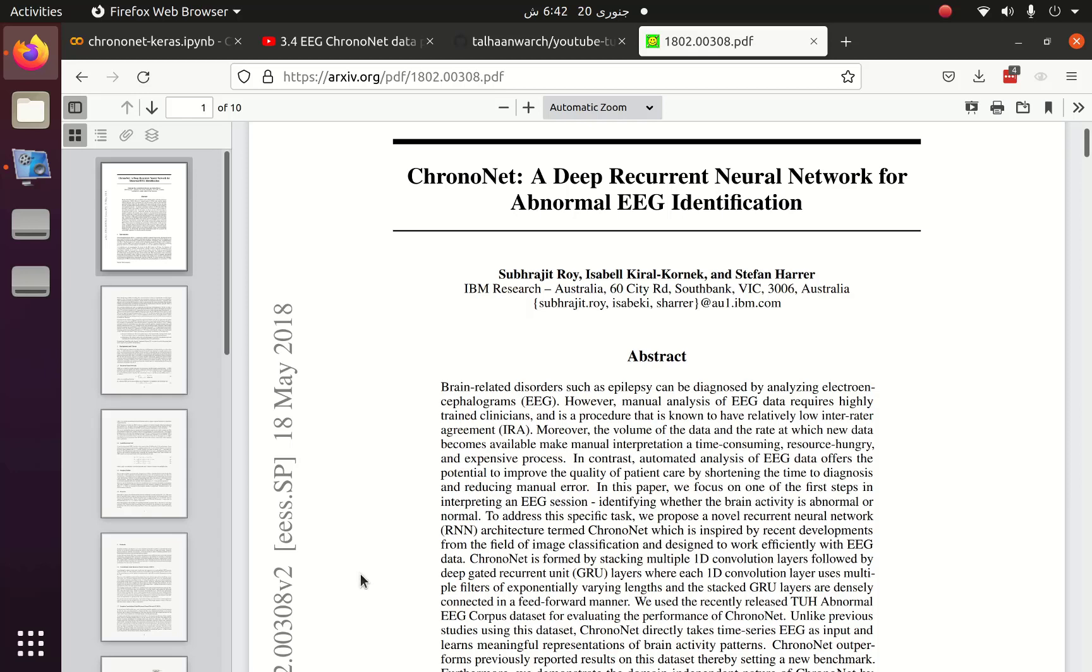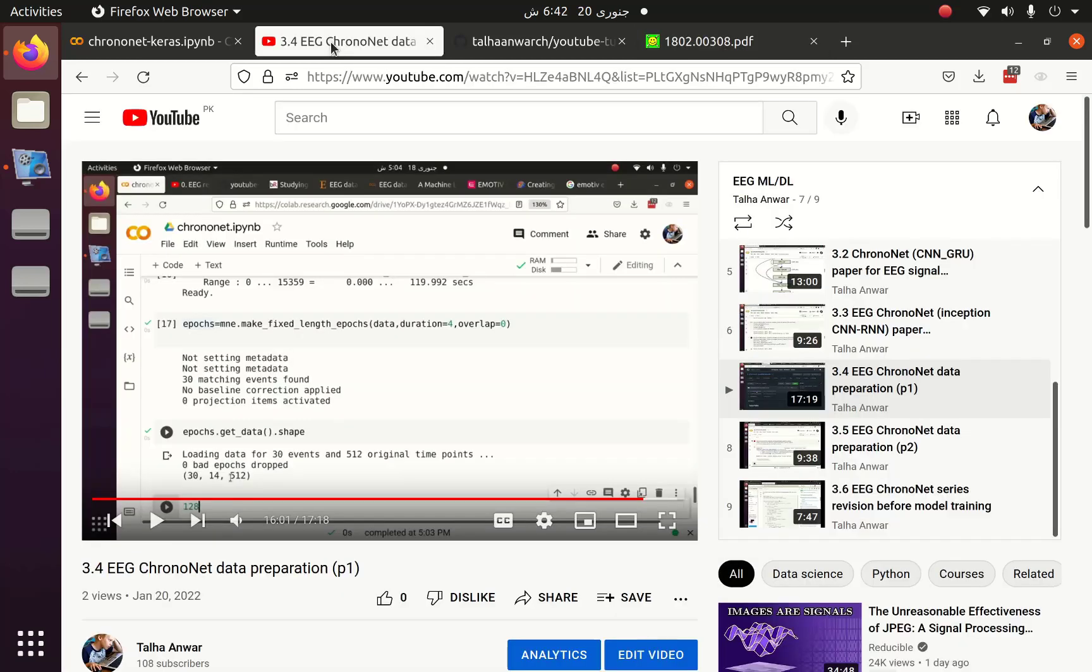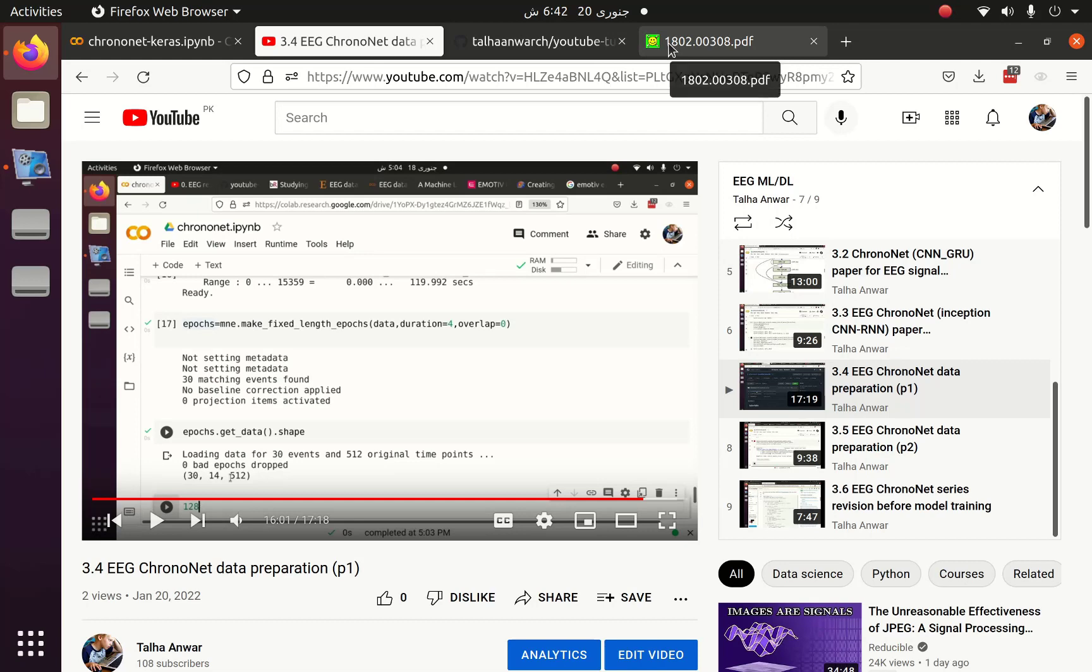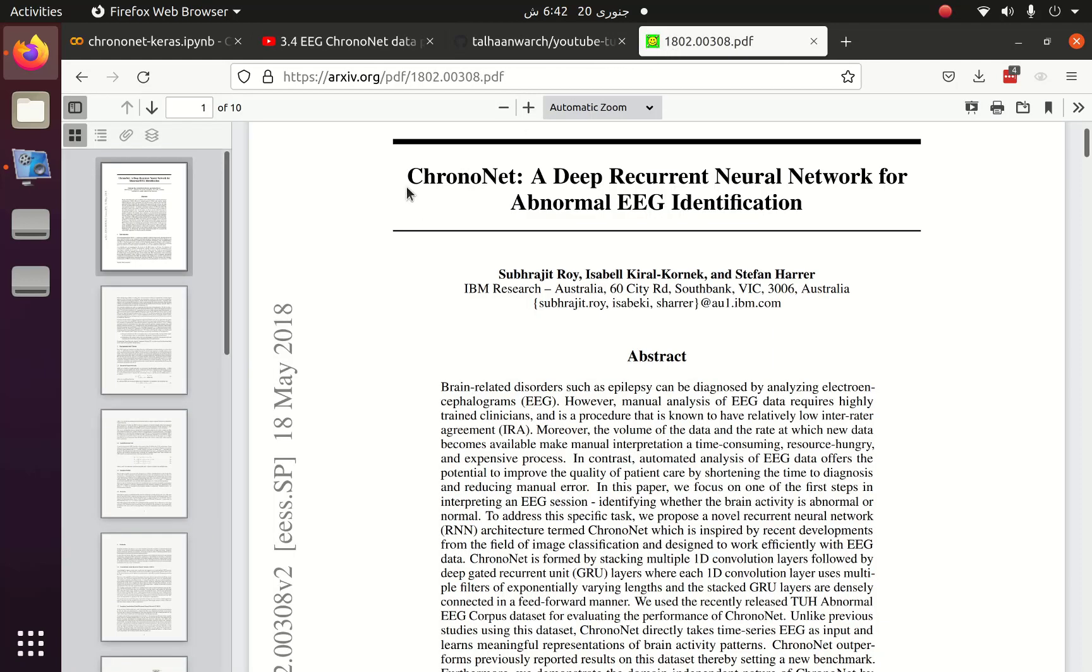Greetings everyone, welcome to part 4 of the EEG MLDL playlist which you can see here. In this part we are going to see how we can implement ChronoNet, a deep recurrent neural network for abnormal EEG identification.